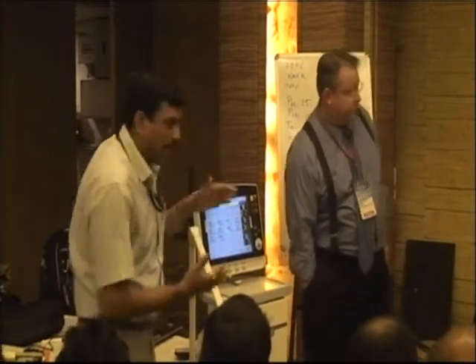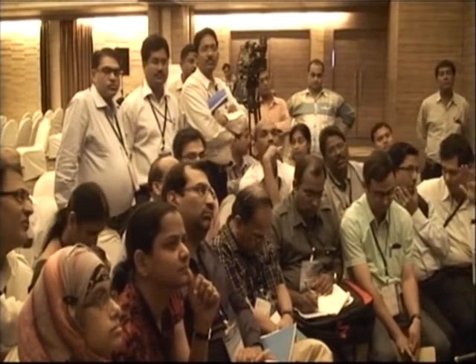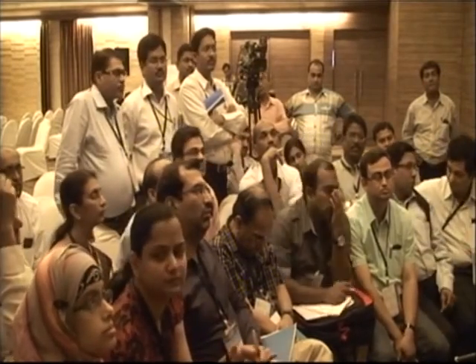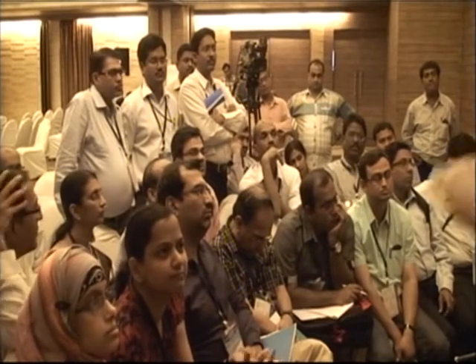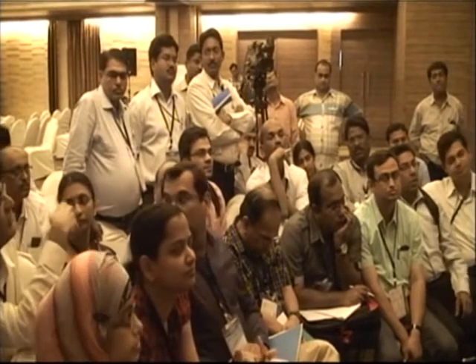What's the maximum? We are limiting the pressure. I think once you get up to 35, everyone gets a little anxious. APRV pressure is high, and you're worried that you're going to breathe too much out of it and overdistend lung segments. But the machine will be able to maintain that. It's really not the pressure, it's P high. Try to maintain the pressure.